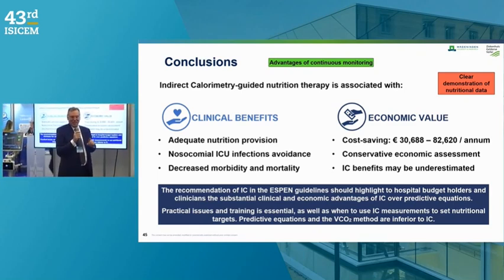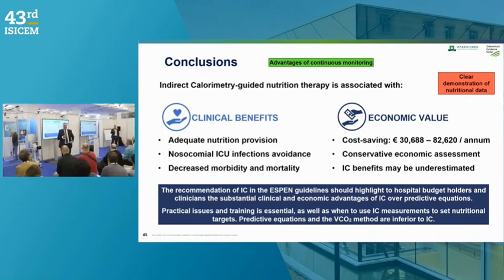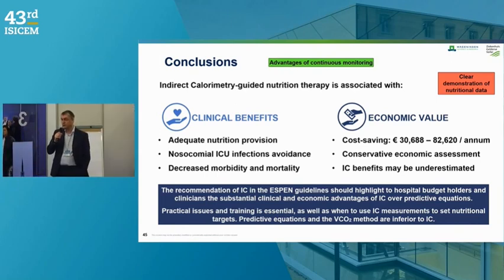And that's another question. The first question was about PEEP. I think it works with PEEP over 12. We use higher PEEPs in our department, up to 20, and it works very good. And it's not only the indirect calorimetry we need to compose the nutrition. We also look for laboratory parameters for blood glucose, insulin consumption, and things like this. And so we have a lot of parts for composition of nutrition in our patients.